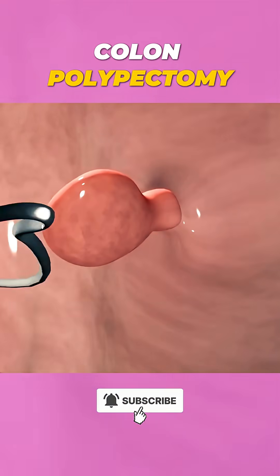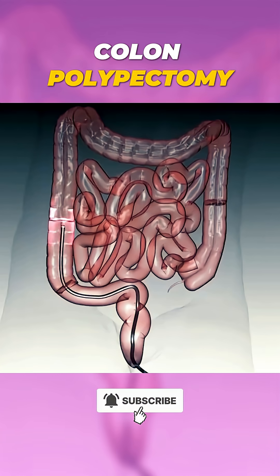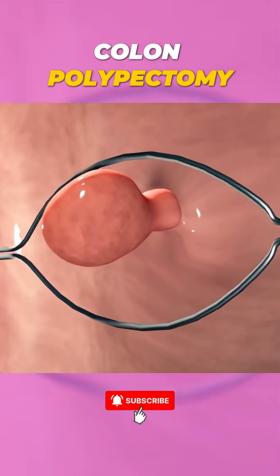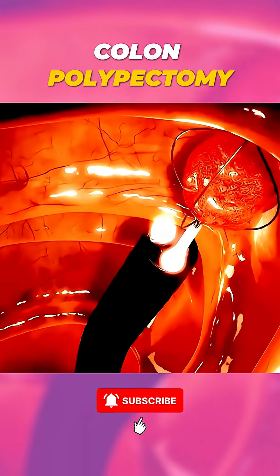Ever wondered how doctors remove polyps during a procedure called a polypectomy? It's a minimally invasive surgery used to take out abnormal tissue growths, often found in areas like the colon or stomach. Here's how it works.